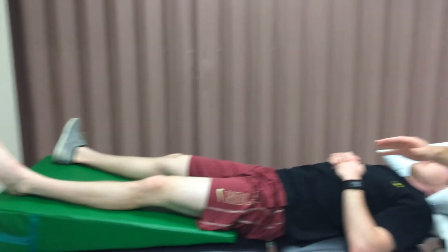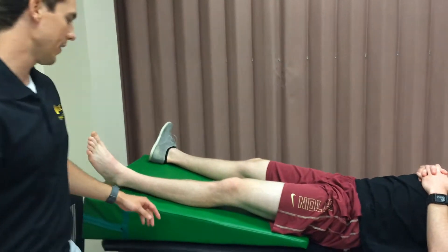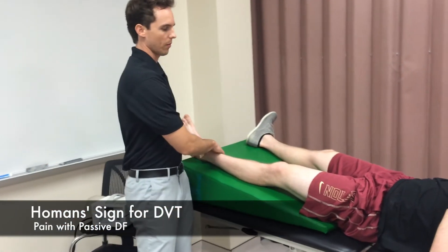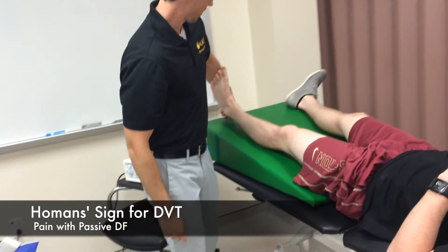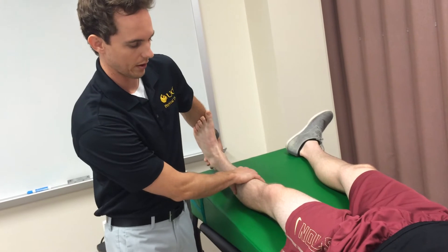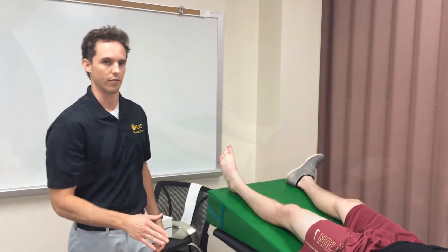Since we're not treating deep vein thrombosis but trying to prevent it, we want to make sure our patient does not already have a deep vein thrombosis. That would be indicated by pain, swelling, redness of the calf. I can assess that by performing a Homan's sign on our patient — putting him into passive dorsiflexion and checking for pain with the calf. I could also give the calf a squeeze to increase the pain. That would indicate a current deep vein thrombosis, and treatment would not be indicated.